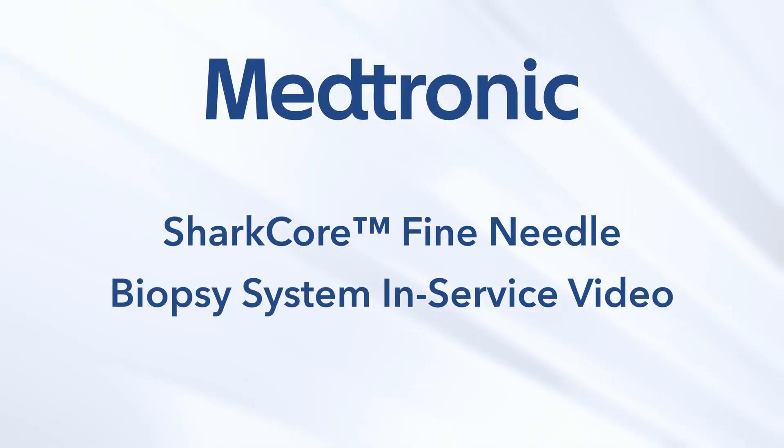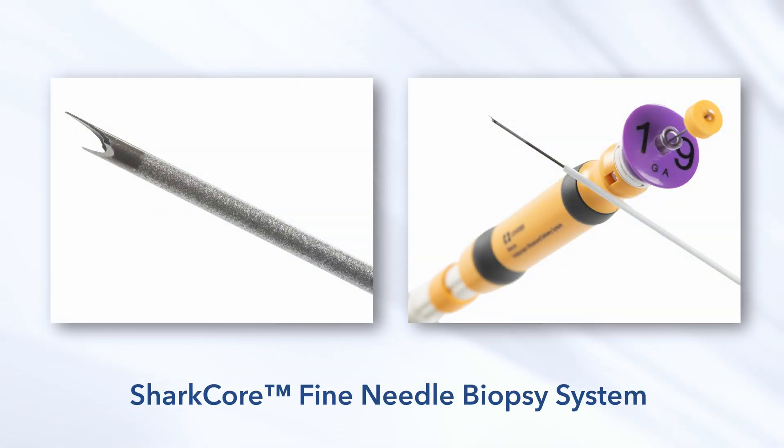Welcome to the SharkCore Fine Needle Biopsy System in-service video. In this video, we will cover the essential information about the SharkCore FNB device, its setup, and the procedural steps to ensure effective and safe usage during endoscopic ultrasound procedures.